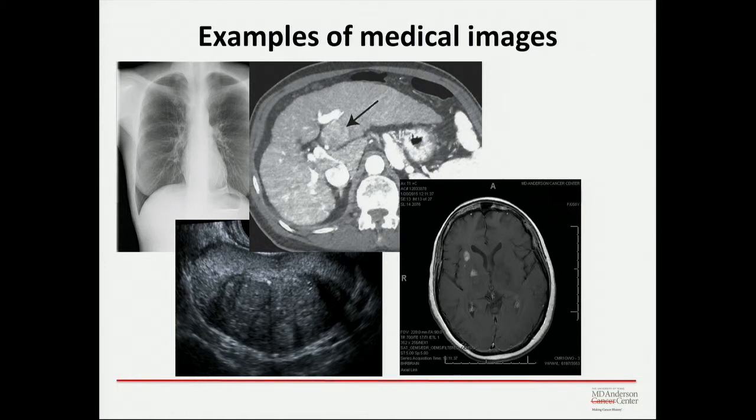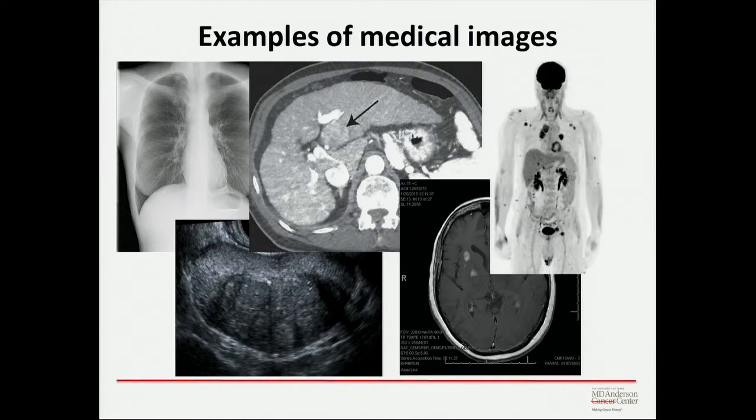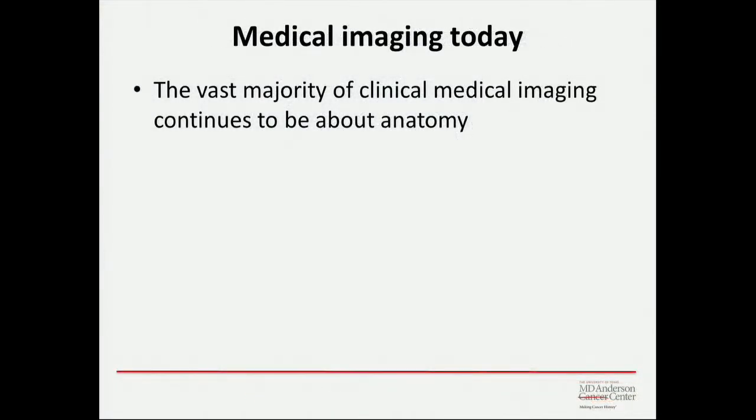And then finally, nuclear imaging, and in fact this is a PET image, is very different. You don't have really good resolution, but you begin to see function. And so you can find lesions. They're typically used more for screening, looking for distant metastasis when we already know where the primary is, because now we can find that distant metastasis pretty easily because it pops up out of the background.